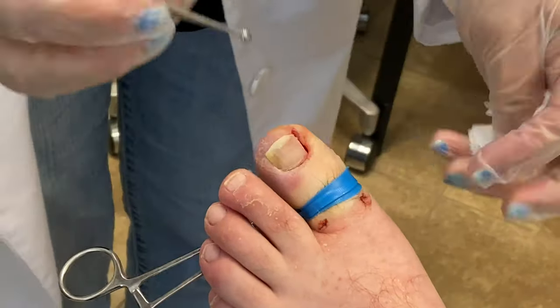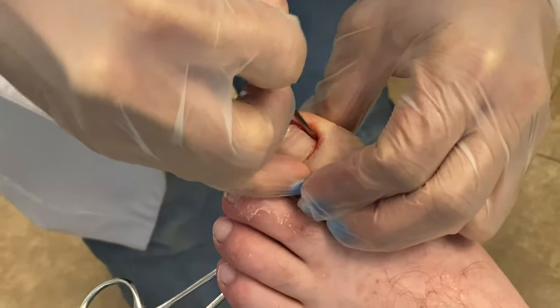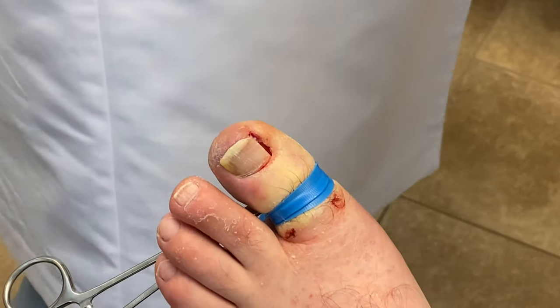The next step is to take a curette, which you can see I'm doing here. This sort of wakes the cells, if you will, to accept the acid so that we're able to kill the matrix that the cells grow from.